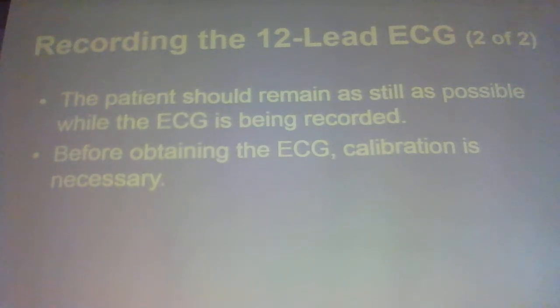All right. So, all this stuff, obviously we would like to have them in a supine position when we do our 12 lead, but we know that if they're having chest pain and shortness of breath, they're probably not going to tolerate that. So you get them in a position of comfort, and then try to make them as still as possible. Things that interfere with it, if they're cold, if they're moving their hands, tapping their feet, if they're gripping the rails of the cot, that's going to mess up your 12 lead.